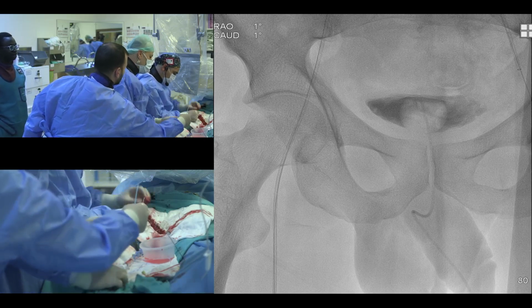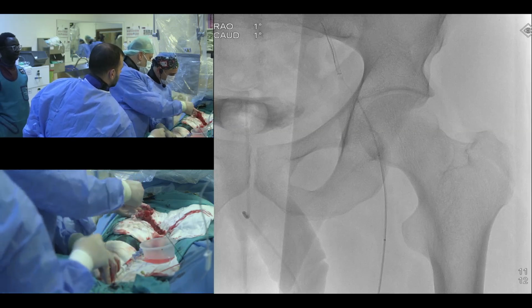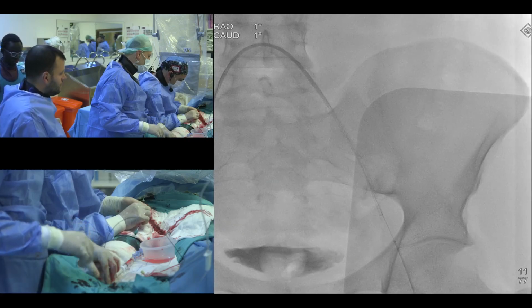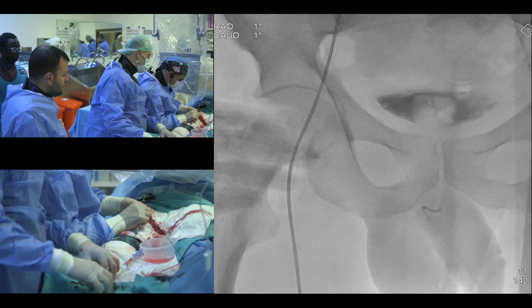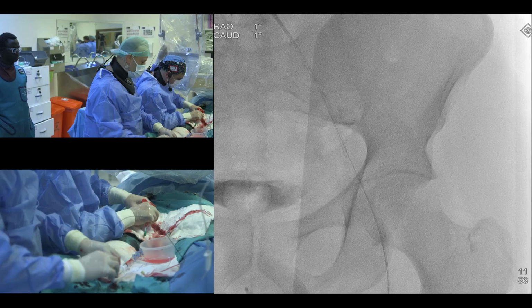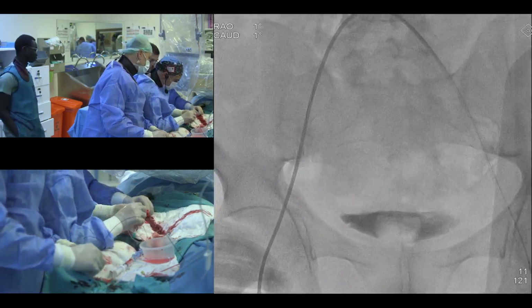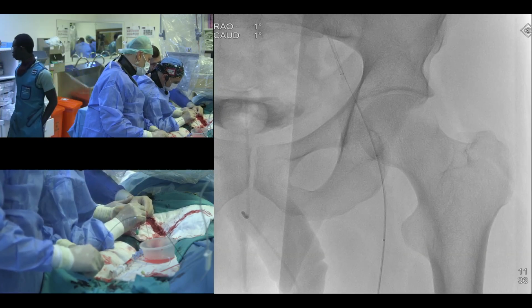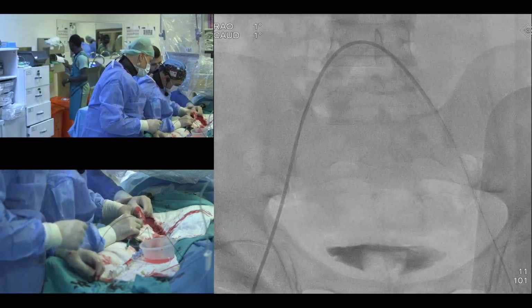Ha, o da olur ya da. Nasıl? Ha, onu ver. Dilatatör. O daha rahat olur. Buradan girmeyebilir ama sen girdin, harika. Ucu biraz yamulmuş. Keselim mi? Yok, sokarız. Biraz daha gönder, çıkarsa atıyor. Tamam. Aynen, iyi olur.